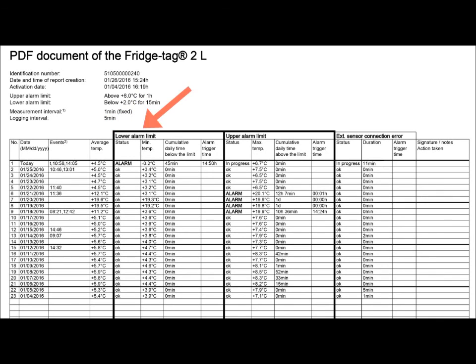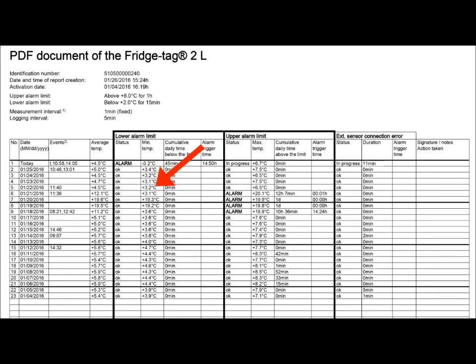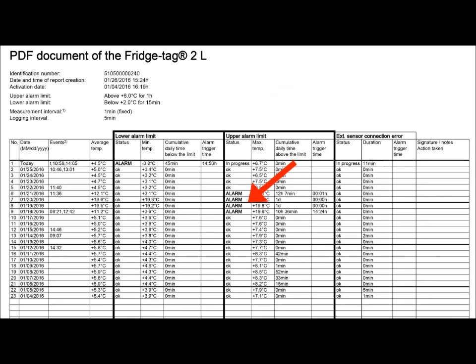Here we see the information around low temperature recorded each day and that it was okay and above 2 degrees C. And here we see the information on the upper temperatures recorded each day, and we can see here we have four days of alarm temperatures.